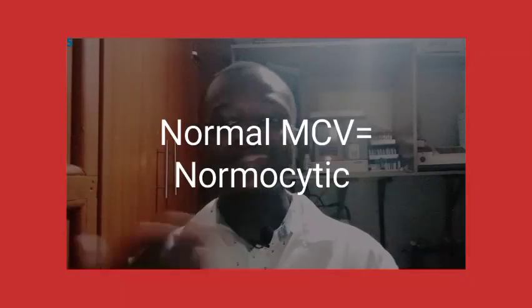MCV is also an important aspect that we use in characterizing the types of anemias. For example, normal MCV, we call it normocytic anemia. In a situation where you have anemia but your MCV is presenting as normal, we will say it is normocytic anemia. Reference range is from 80 to 100.